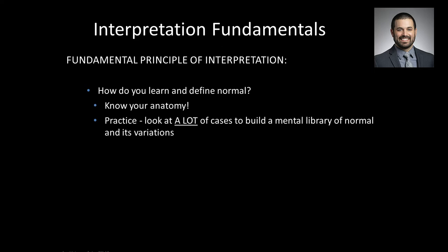But two, the second approach is practice. Look at a lot of cases. So just by looking at every single case you acquire in your office, even if it's for a couple minutes, your brain will passively take in that mental map of anatomy and start to build a tolerance for what is normal. And remarkably, I teach this to our dental students and residents.